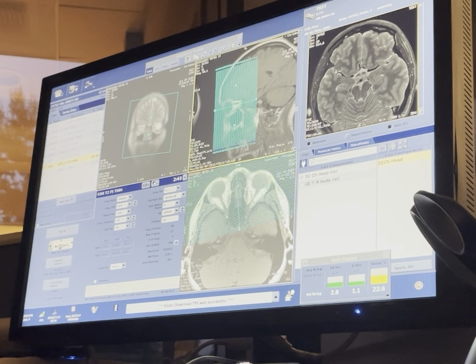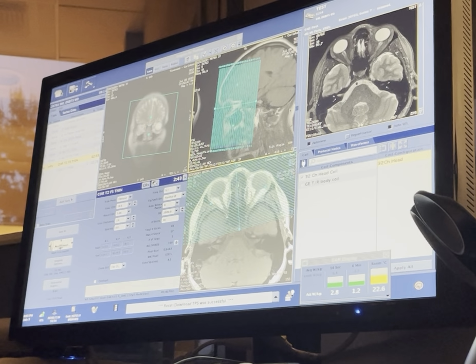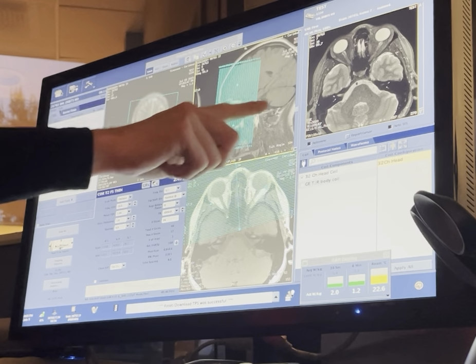Keep going. Don't be shy now. Keep going, keep going, keep going. Yeah, there you go. That looks good. Now scroll through, like one more. Keep going. Go the other way. Other way. Keep going. Oh, all right. That's all we can see. So go back. Looks good to me, because it's supposed to flatten out a little bit.